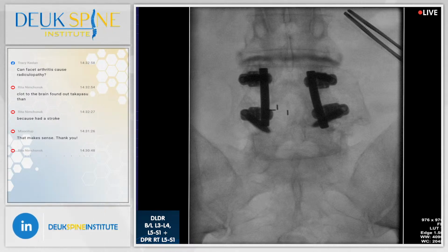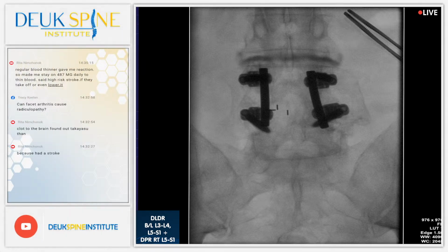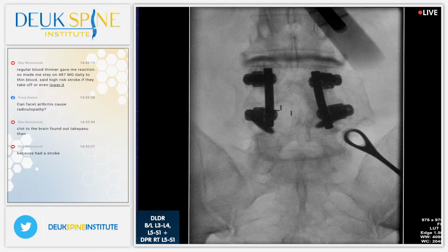Tell me when you're ready, right here. All right, we're going to shoot. Okay. It's going to be fun. That's one. Make a little incision, and we're going to treat his facet.